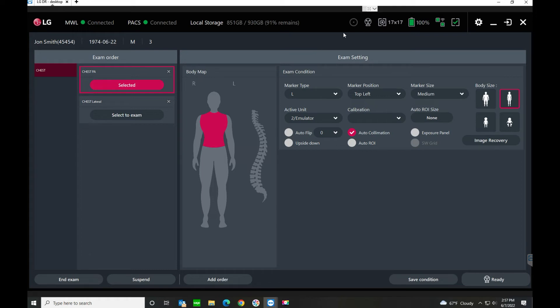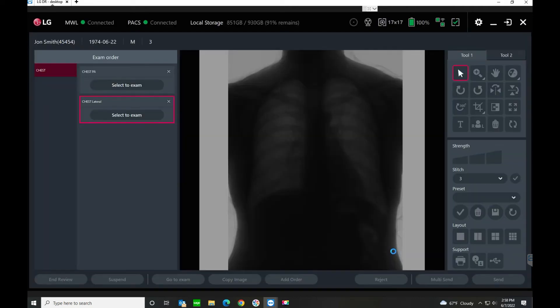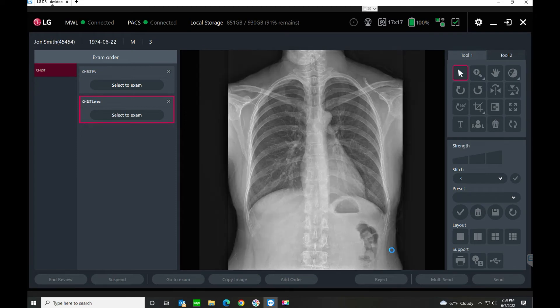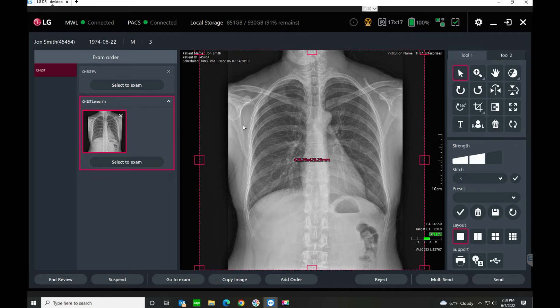Because I'm in a demo system, I have to press a button to simulate this exposure. But in practical use, the radiation button would be turned amber and I could just make the exposure and the image would come up. The image uptime is less than five seconds to have a processed image. Now you've got a processed image in your viewer.